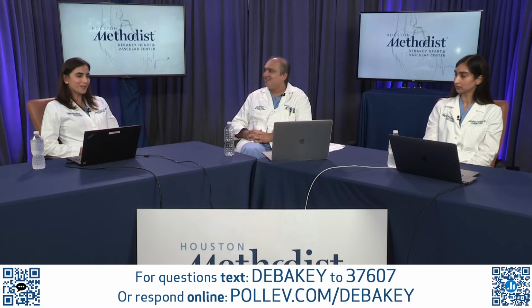It's a very good question, and I think the bottom line and the first step is if I have appropriate PPE for the staff and the people involved, I think TEE is the way to go. And we can assess for vegetations, we can see valve destruction pathology.